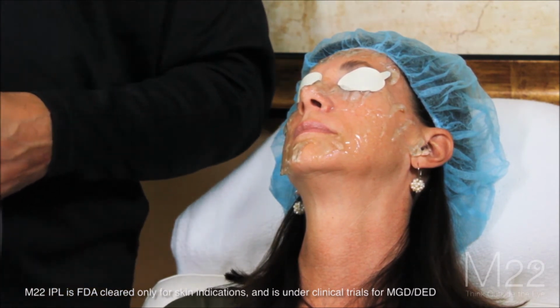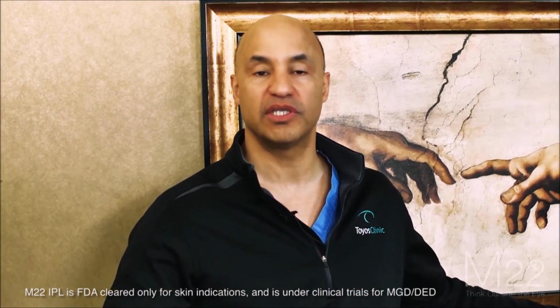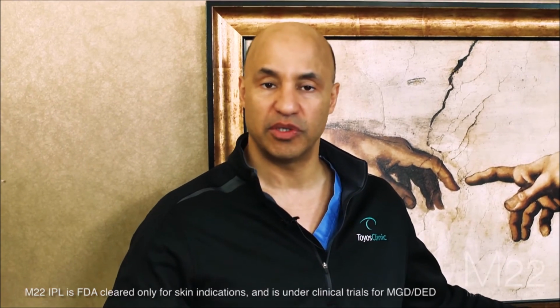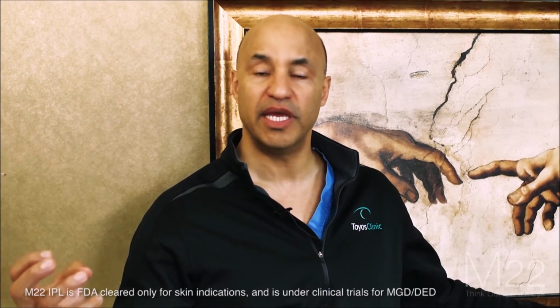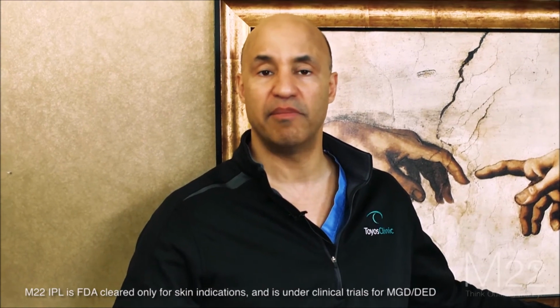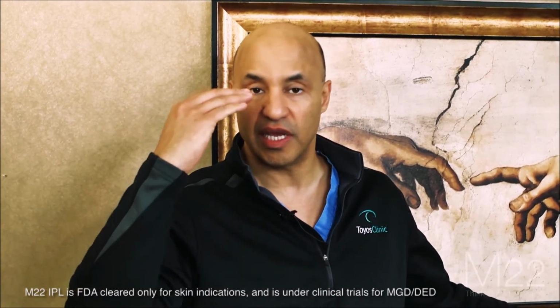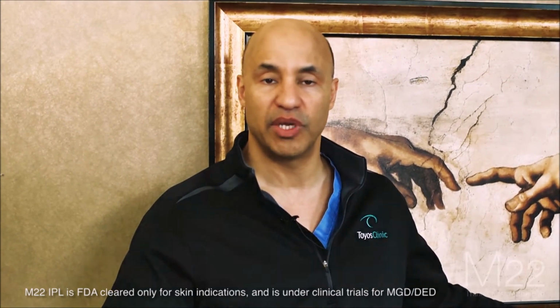We want to take away the gel. So once we're done taking off all the gel, now we're going to bring the patient over to the slit lamp, and there we're going to do meibomian gland expression. What we found was when patients get intense pulse light, IPL, to the skin around the lid margin, there's some heat generated in the dermis which will actually dilate the meibomian glands and melt the secretions. And as I said before, there's a heat wave that goes from lower to upper, so we actually get that same effect of heating of the upper meibomian glands, so those secretions get melted so that we can express those as well.